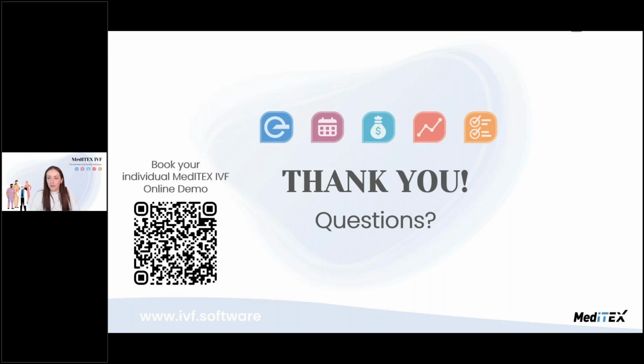Thank you. How long would implementation of MedITEX take at a clinic? This is a very tricky question because it really depends on the scope and on everything that you need, interfaces, different modules, how many people are, for example, going to be trained. So this is also a thing to talk about in a one-on-one meeting, so I can give you a better answer if I understand your requirements and your needs.